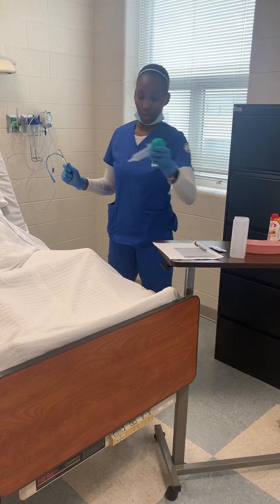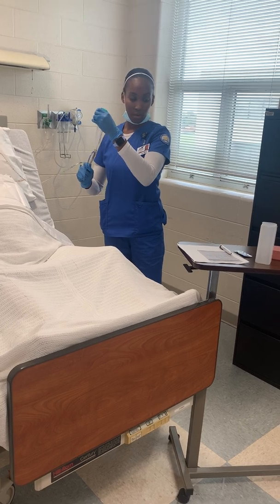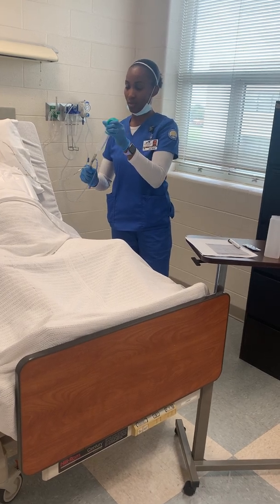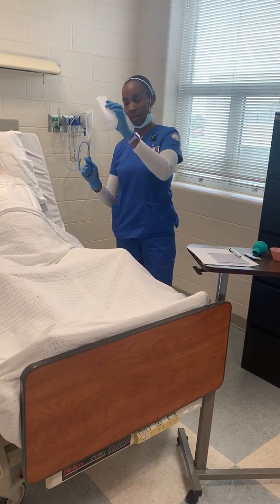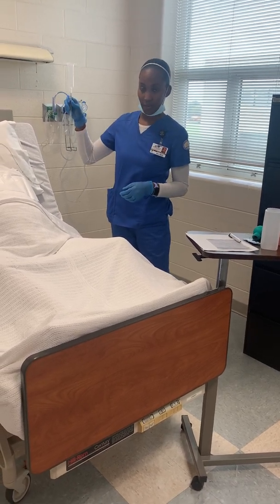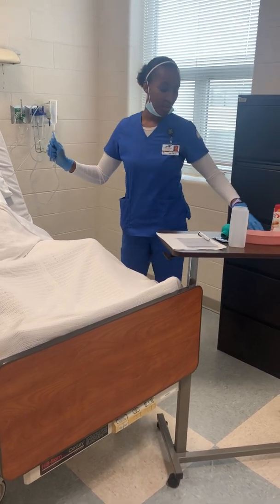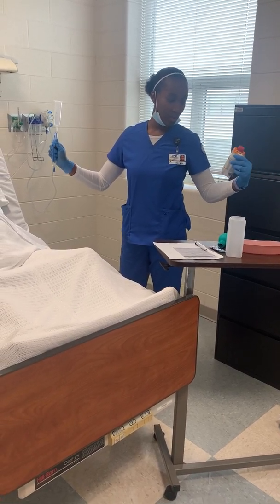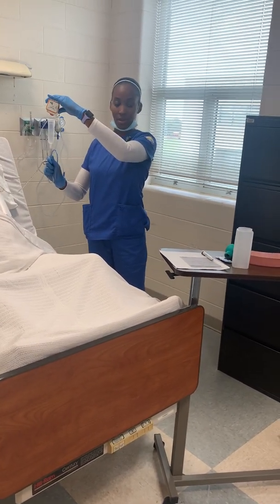I'm going to hook this up. And then I'll get my flush, 50 ml, pour that in. And then administer that 18 inches above the site. Crank it back. I'm going to wipe off my Lucerna label, shake it up, make sure it's right. And then I'll administer the 100 ml.